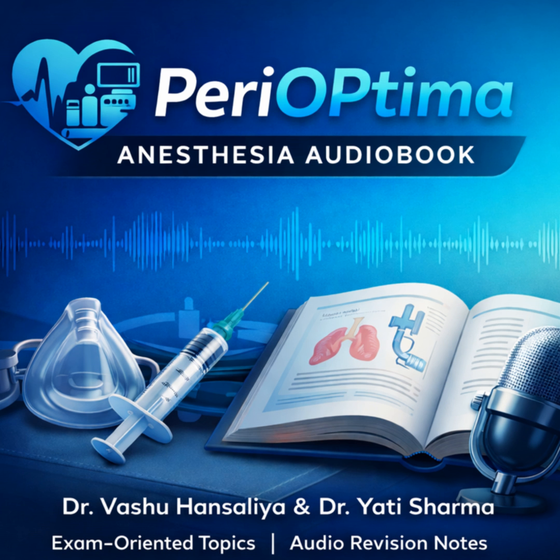And it's synchronized, right? Yes, that's the S. The ventilator has a window of time. It waits for the patient to make an effort to deliver the mandatory breath, syncing up with them. If no effort comes, it will deliver a time-triggered breath at the end of the window. It sounds like it would prevent that fighting the ventilator feeling. But you mentioned there's a specific warning about SIMV, especially when it comes to weaning.